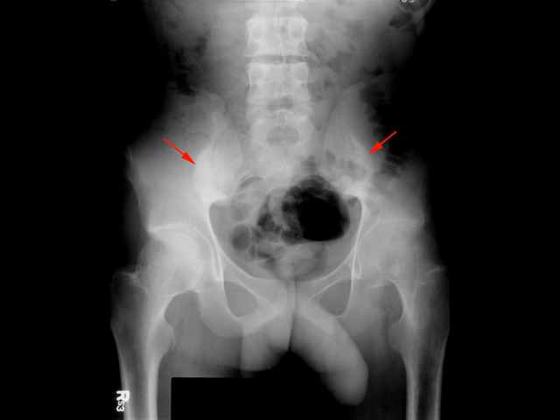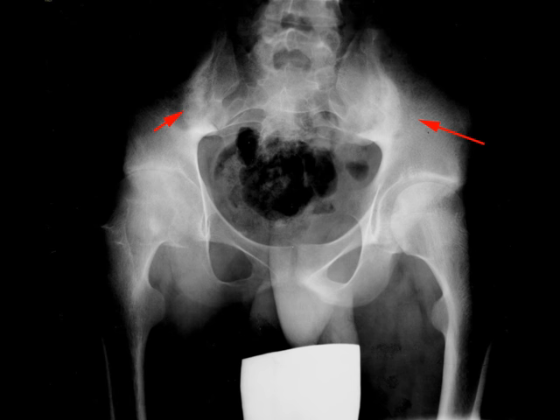The red arrows demonstrate sclerosis along the iliac side of both sacroiliac joints, with slight asymmetry and greater involvement of the right sacroiliac joint. The second image is windowed for better visualization of the sacroiliac joints. No discrete erosions are identified.